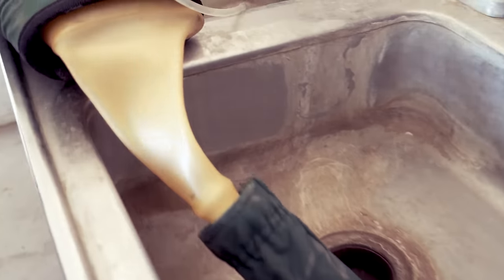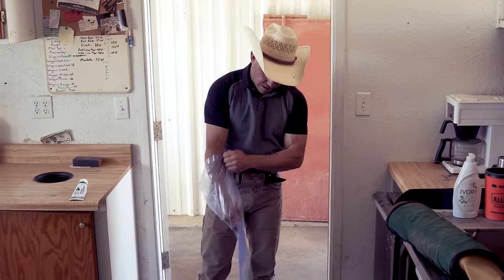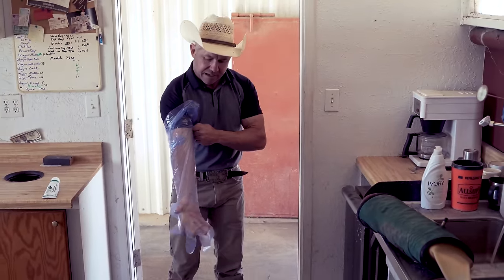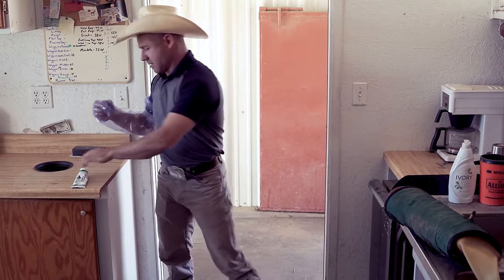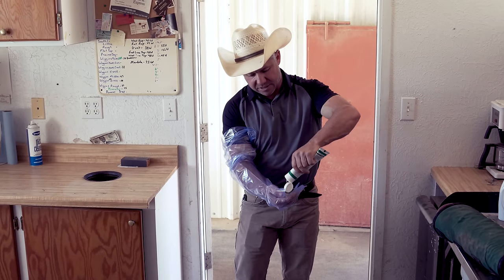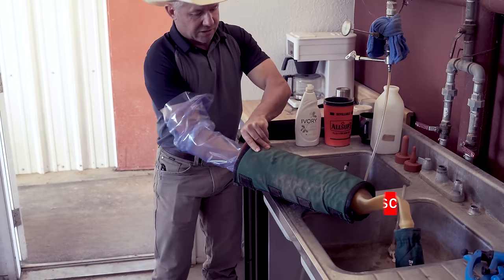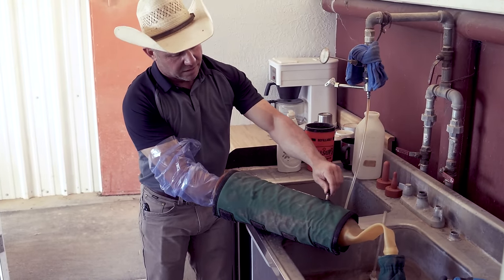So now once this is warmed up, I'll put a glove on and we'll lube it up. We're ready for the wreck. So I'll have the AV in this hand, and then this glove will be the glove, and I keep my hand in the AV to keep it warm while we're waiting on the stallion to get ready. So it's just not like a slam dunk deal. You don't just run in there and they jump. At least my stallion doesn't. And essentially what I'm gonna do is lube it up, and it's way too tight right now. So I'm gonna let some water out.